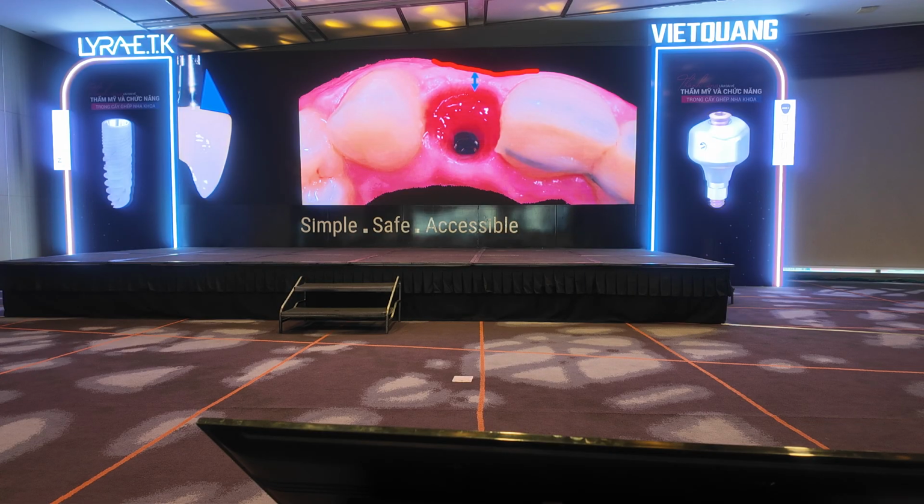But when you extract the tooth and you know that you have a thin biotype, if you react during the first extraction and the first implant positioning by grafting the bone and using this kind of abutment, you push in the right part, you push down and you already have a base.